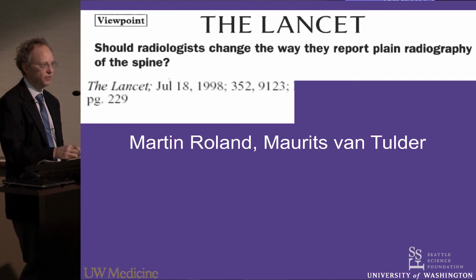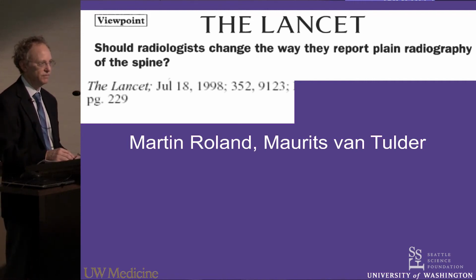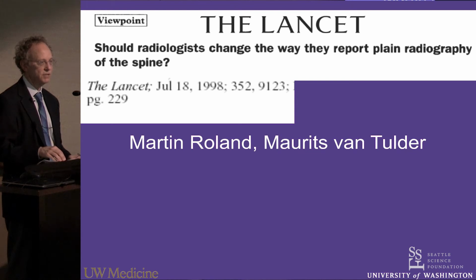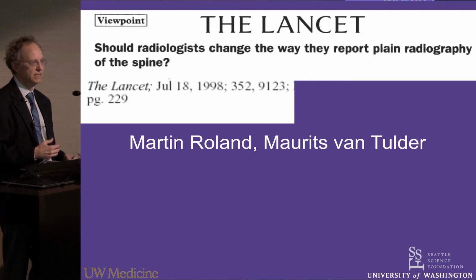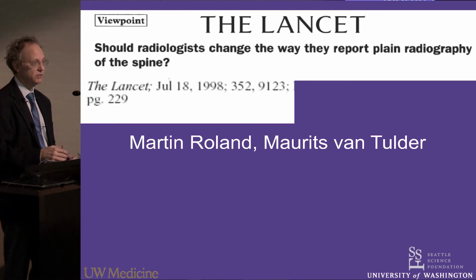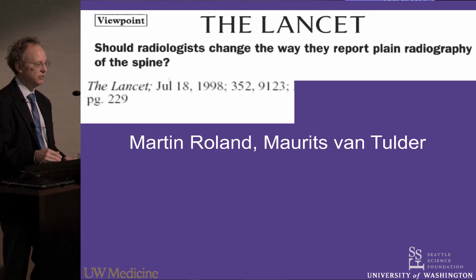So, of course, the problem with that is that, how do you ferret out all of these highly prevalent findings in people that don't have back pain and are probably clinically not important from those that are clinically important? And what is the impact of us reporting all of this stuff on patients and primary care docs and specialists who end up needing to explain all of this stuff to patients?